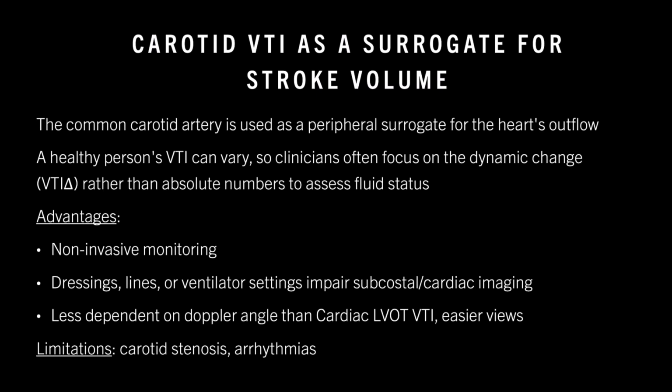The advantages here being that it's non-invasive monitoring, and dressings, lines, and vent settings that can oftentimes impair the subcostal, like cardiac imaging for performing an LVOT VTI, aren't really getting in the way with carotid VTI. It's also less dependent on the Doppler angle than the cardiac LVOT VTI, and the views overall are easier to obtain. Some limitations could include carotid stenosis or arrhythmias.